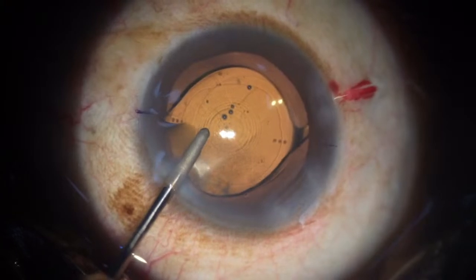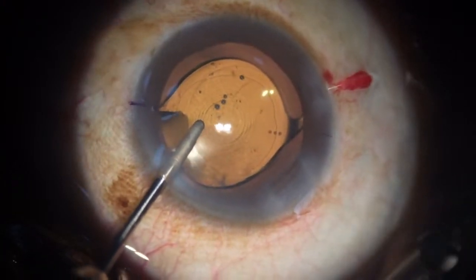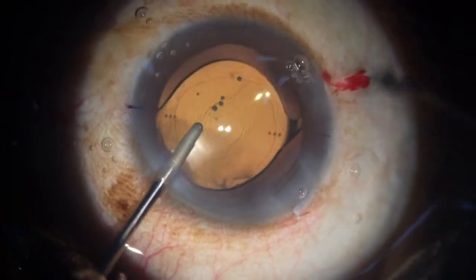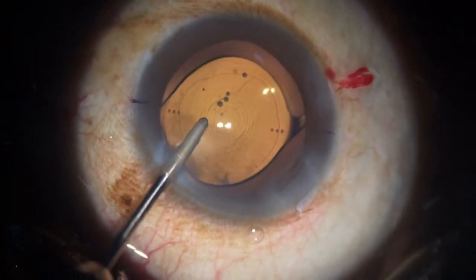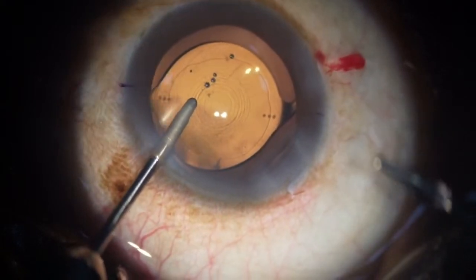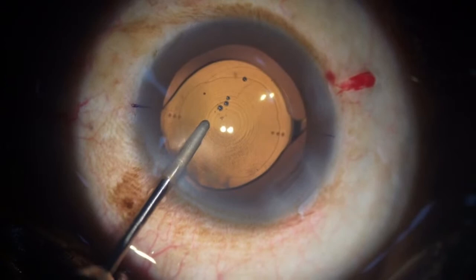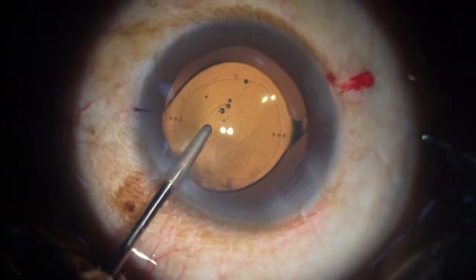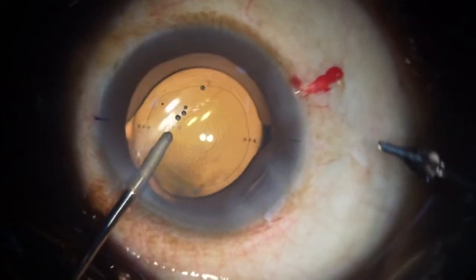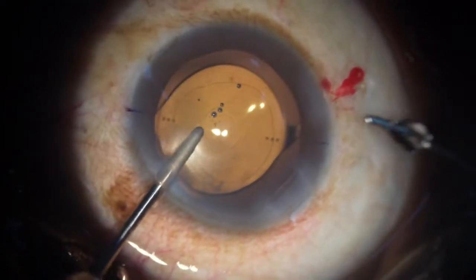I mean, he gave me that. I usually prefer to use a wide-tipped spatula, but he gave me my aspiration thing, so I just used it. I know it's very finely sandblasted, so I don't normally use it. I normally would use just a wide-tipped manipulator, and that can damage the lens. But here I was just careful not to touch the center of the lens.